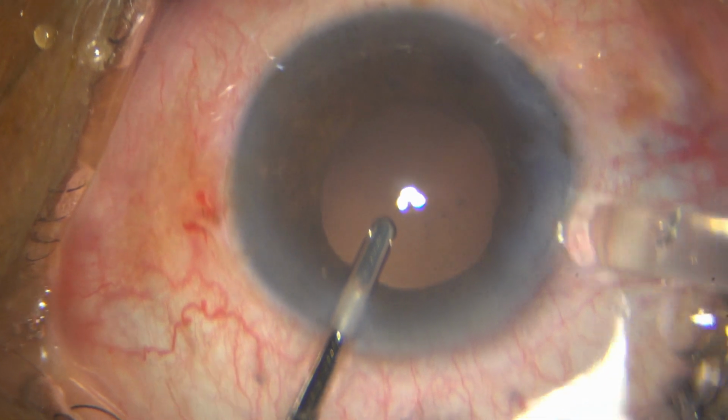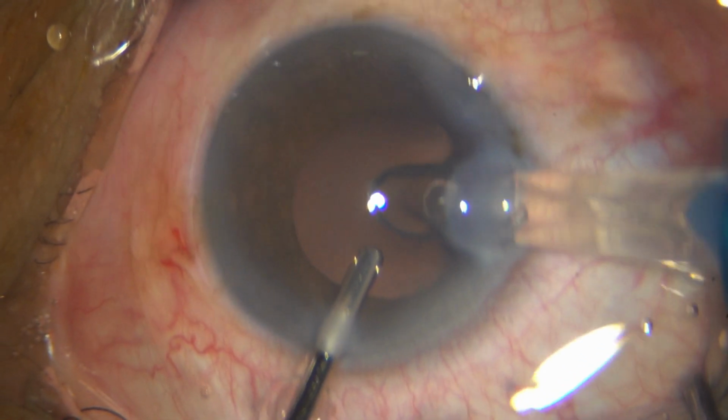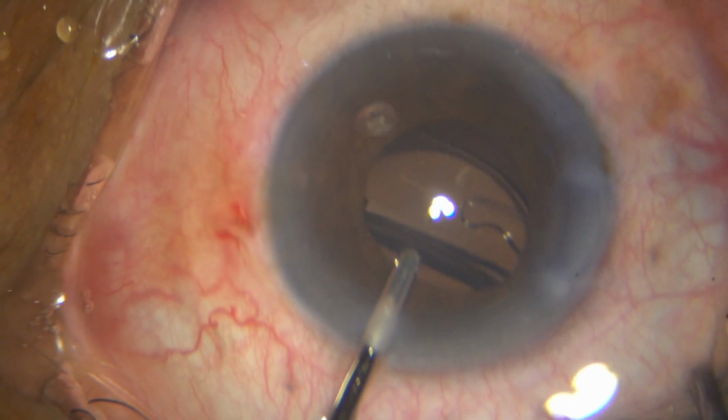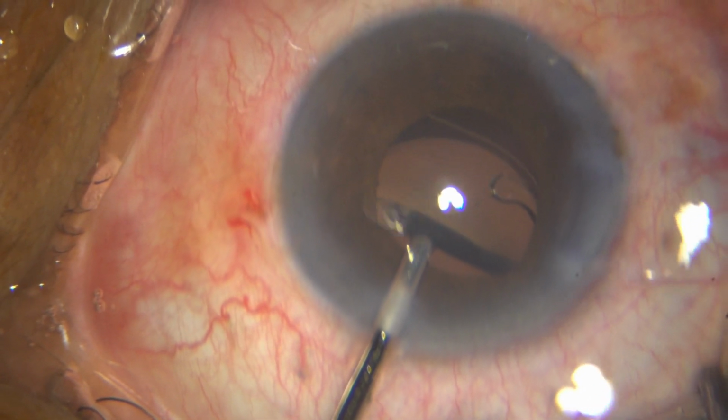Then under hydroimplantation, I am introducing this single piece hydrophobic IOL. I am trying to introduce it directly into the bag. It has gone into the bag. I just help it along with the Sinskey hook as well.